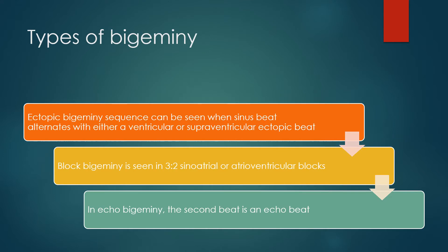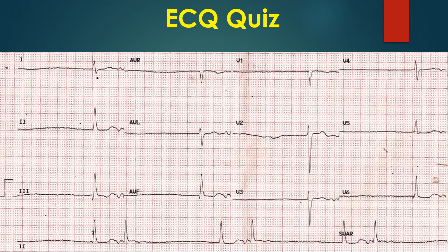Ectopic bigeminy can be seen when a sinus beat alternates with either a ventricular or supraventricular ectopic beat. Block bigeminy is seen in 3:2 sinoatrial or atrioventricular blocks. In echo bigeminy, the second beat is an echo beat. Here is another ECG with a bigeminal rhythm — what is the diagnosis?